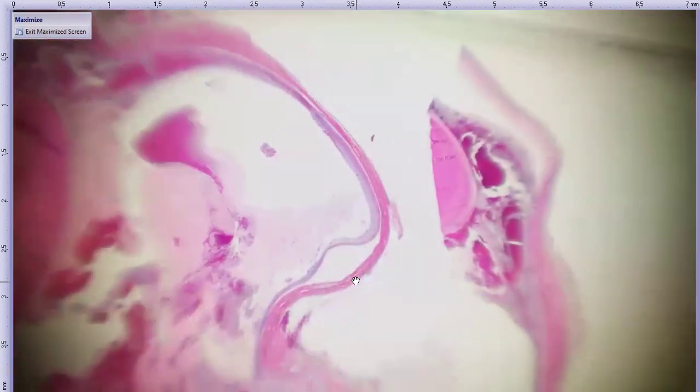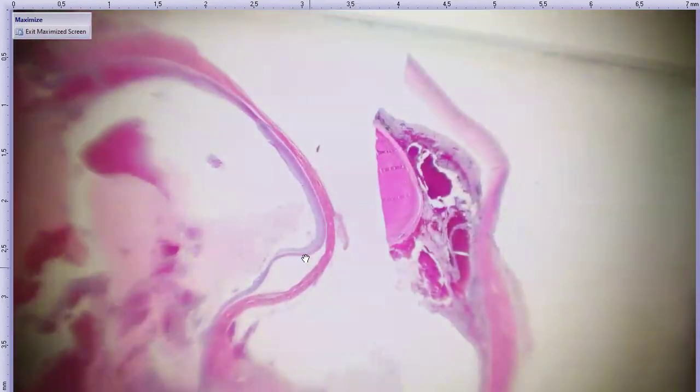Back here we have detached retina that's not completely sampled, but there's a bunch of hemorrhage and some high protein material there in the subretinal space. And then I'm going to draw your attention to this area here, which is a little bit busier than it should be. So, dive in.